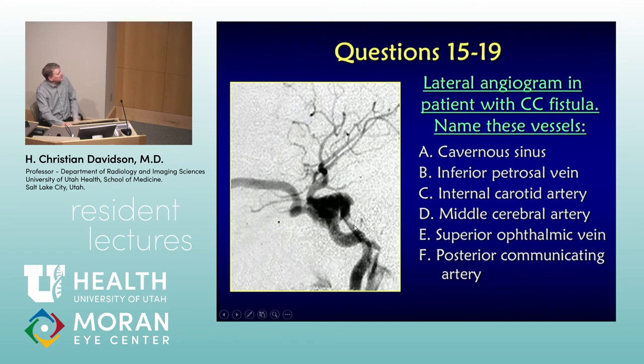Okay, so an angiogram is performed by putting a catheter in the internal carotid artery in the neck. Usually you put the catheter up on the right side through the brachiocephalic, then the carotid, or on the left the common carotid. When you're doing an internal injection, you like to get the catheter past the bifurcation. The catheters have a little angled tip, so you move the tip around so that it angles into the internal. Usually it's pointed back and lateral. Slide it into the first couple centimeters of the internal, then do an injection with a power injector, and take a series of images over the next 10 seconds.